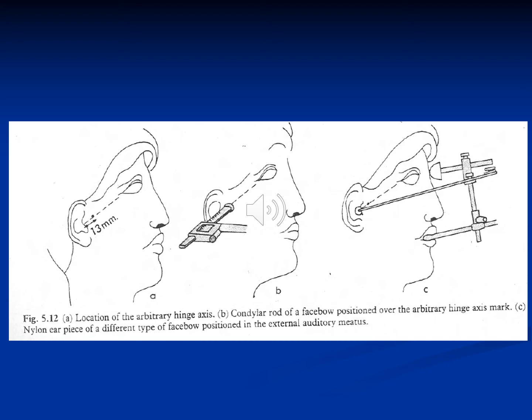And as I said, this is arbitrarily determined. In contrast, in the kinematic face bow, we attach two pieces, one to the mandible and one to the maxilla. On the one on the mandible, we see its movement and adjust its location until it doesn't move in terminal hinge axis movement. By that, we can locate where the axis of rotation is. But as I said before, it's too complicated to be learned in this course, and in most cases it's too complicated to be used.